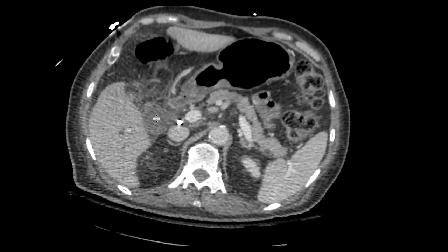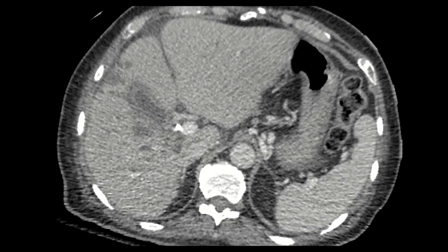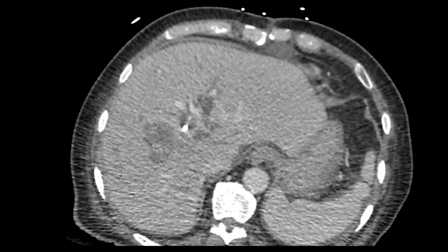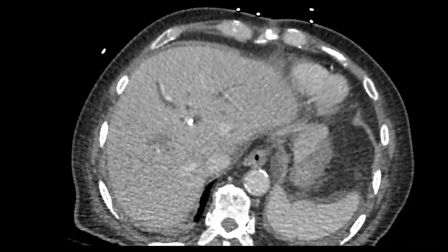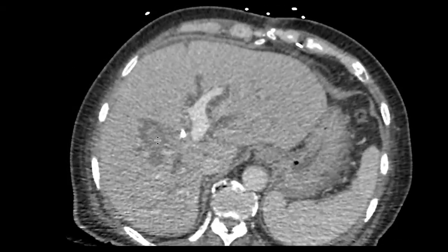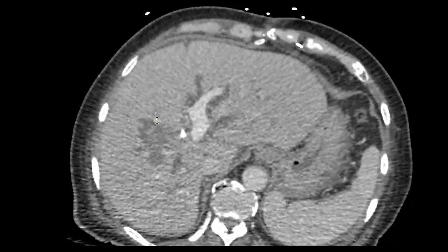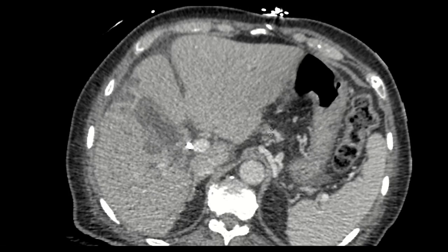There's much less distension of the gallbladder, but there's development of these hypodense lesions within the right hepatic lobe that you can see here. And so there was concern about these either representing infection, maybe a chronic infection such as xanthogranulomatous cholecystitis, or infection related to having cholecystitis, or whether these represent masses. And so we were asked to biopsy these.